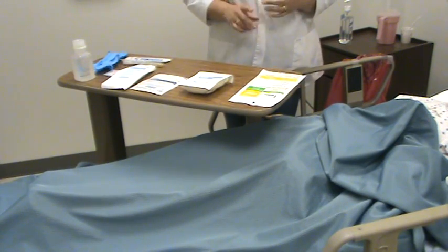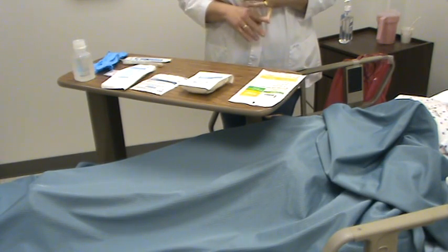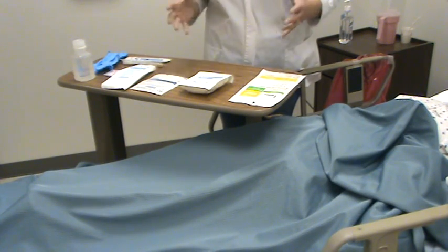We're going to go over the sterile dressing change that you'll be validating in Skills Lab. Make sure that you look at your Mosby discs, the DVDs, because they have excellent information on there. I'm just going to show you quickly the skill itself all put together.